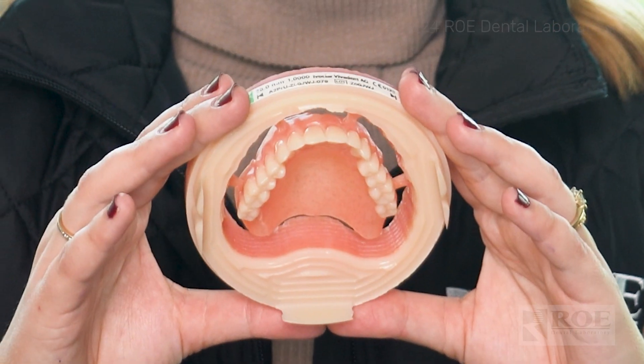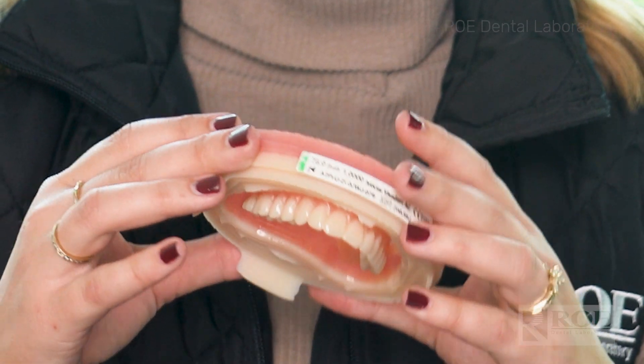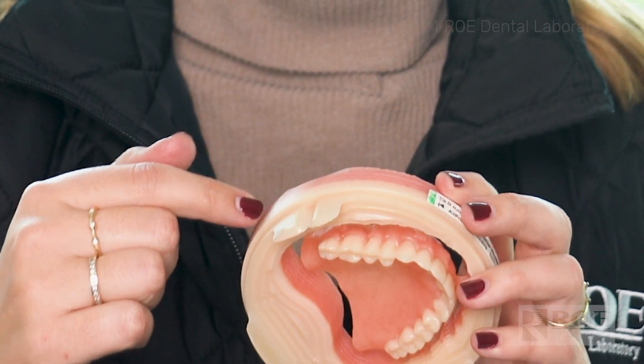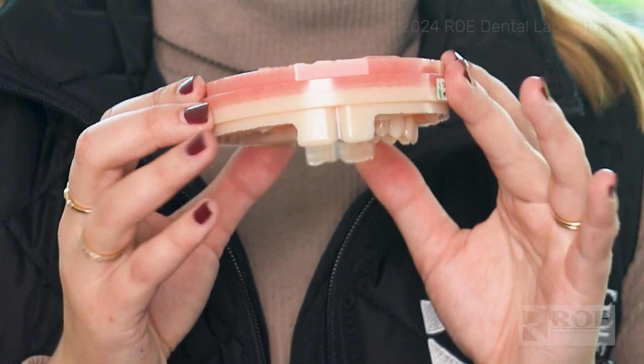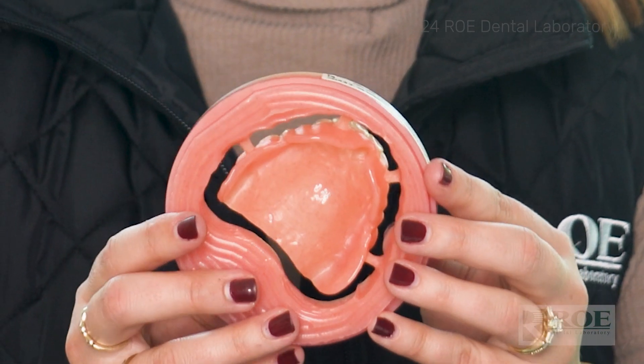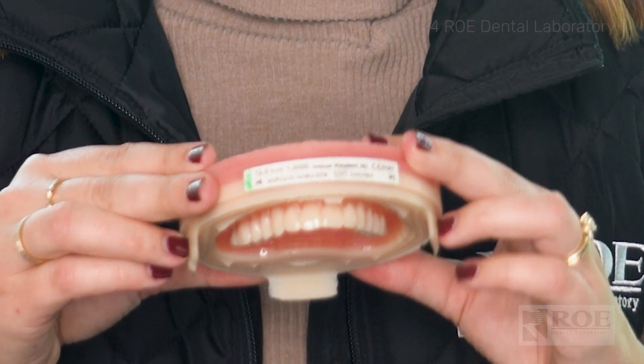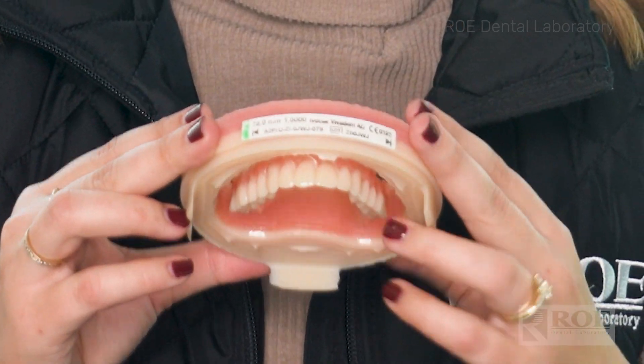The great thing about this denture is how hardy it is because, as you can see, it's one milled puck with dual shades. They use shell-in-shell technology to bond these together. You've got an Ivocat base and PMMA teeth in this milled solution. It's nice and hardy, it can be converted to implant supported, and it's highly aesthetic for those patients who are driven for one of the most premium product offerings we have for digital dentures.